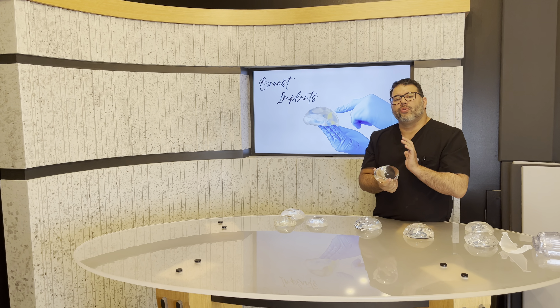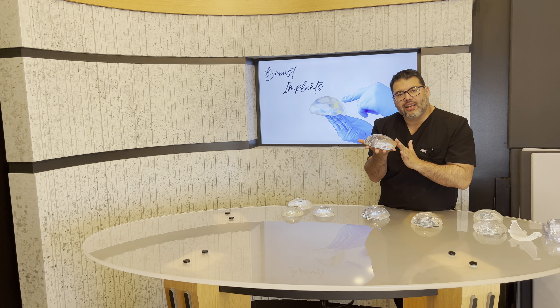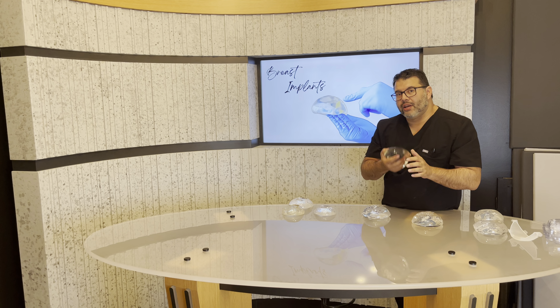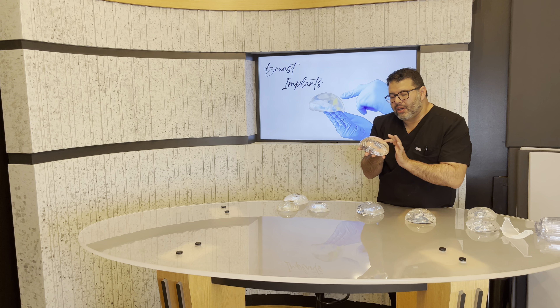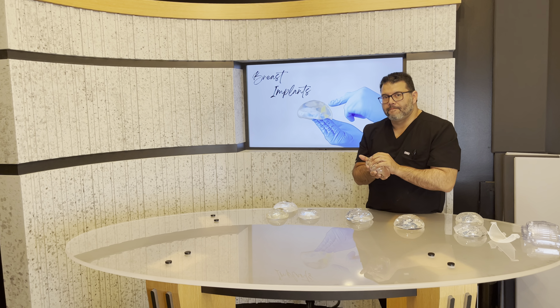It's really, really hard to tell the difference. But the reason I would typically choose one of the gummy bear pluses is if somebody is really at risk for rippling, because it's going to be a little bit more form stable. So you're going to see less of those edges. The plus is definitely a great option if we're worried about rippling for somebody.